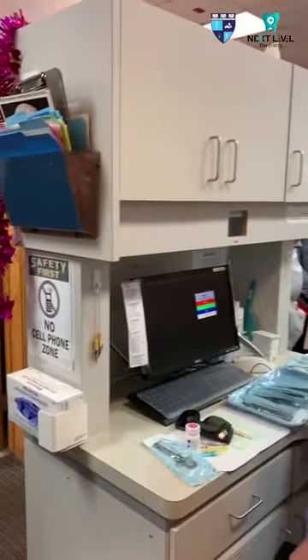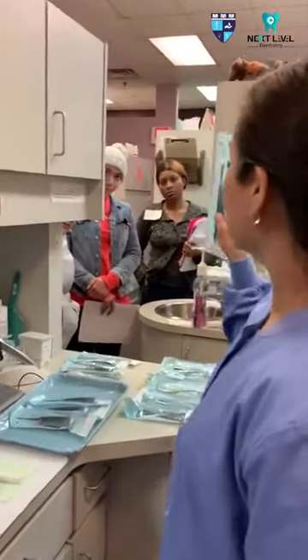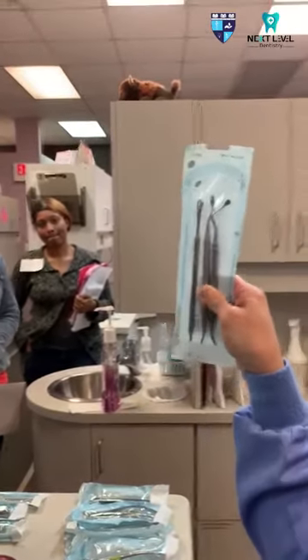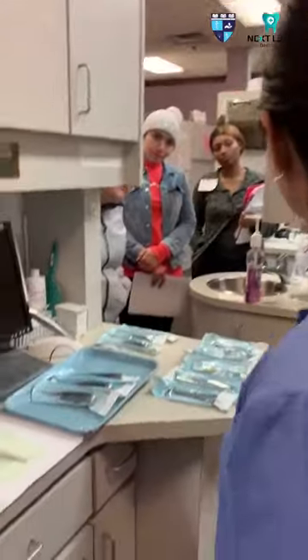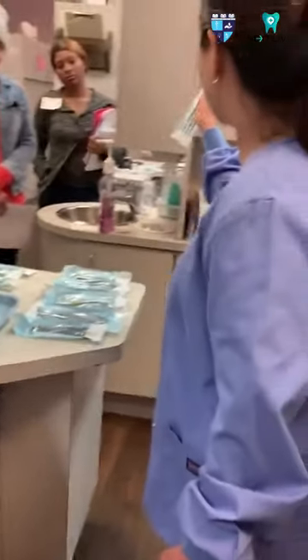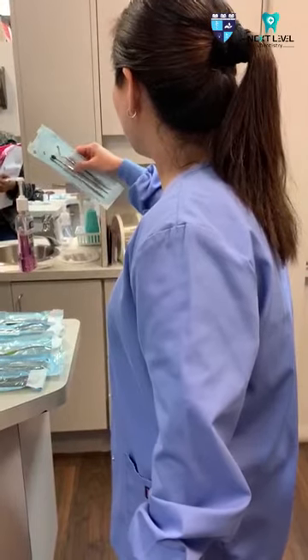This is set up for an extraction. This is packed with the periosteal elevator, the curette, and the bone file. In every extraction, doctors would always start with the periosteal elevator — it has a sharp and blunt side. The curette can be used once the tooth has already been taken out, to check that everything is okay.